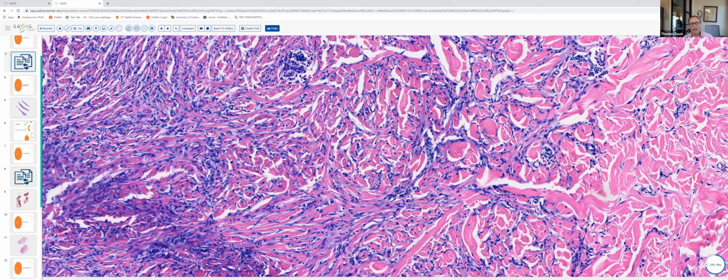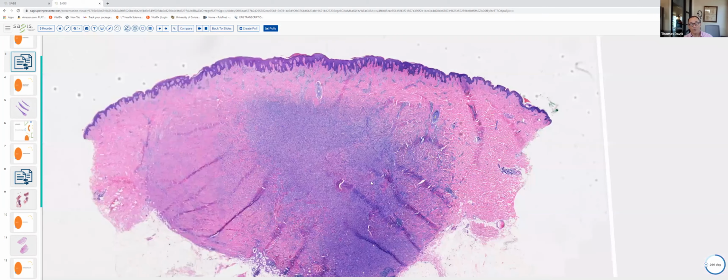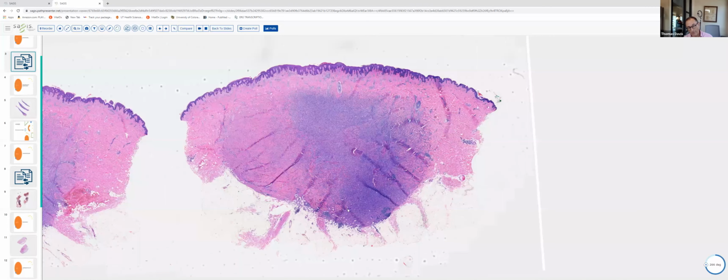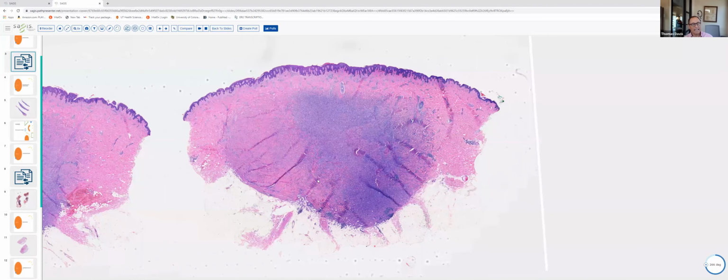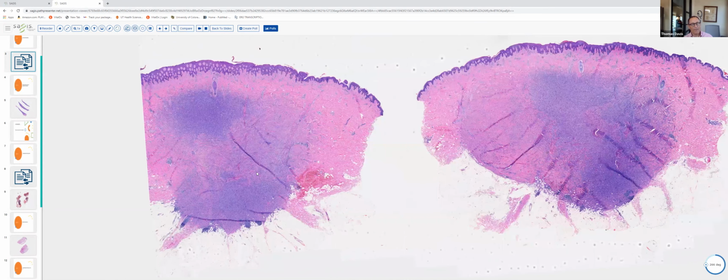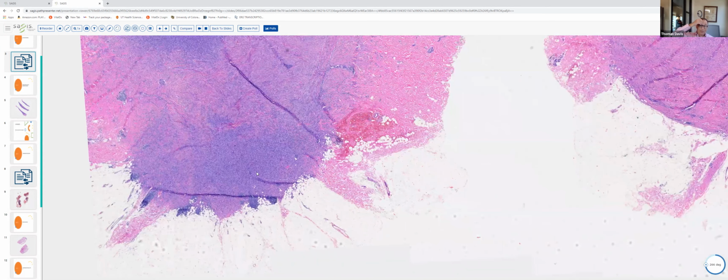What was unique about this particular tumor, and why I chose to highlight it, is you can see this deep dermatofibroma is extending into the subcutaneous tissue. Generally, I've found that when people are first studying dermatopathology, if they see a fibrohistiocytic proliferation extending into the fat, they automatically think, oh, this has to be a DFSP. But deep dermatofibromas, like DFSPs, can extend into the fat. The growth pattern of the two is decidedly different.